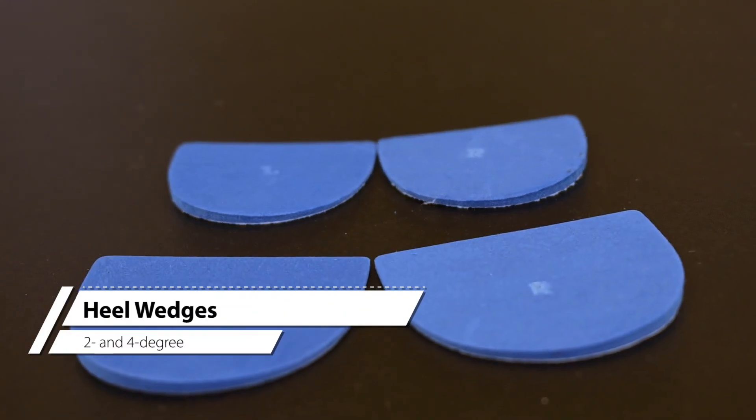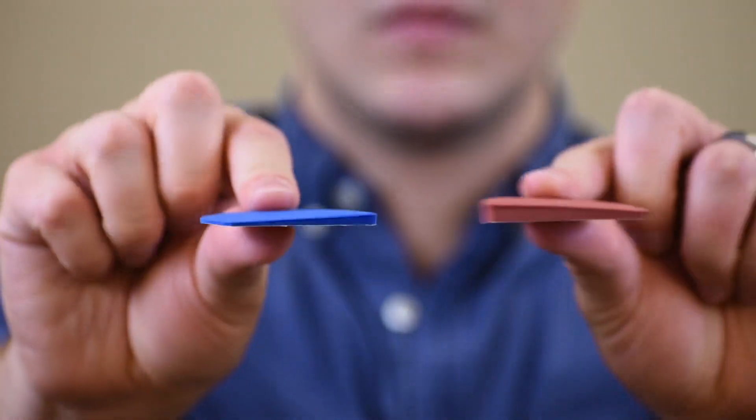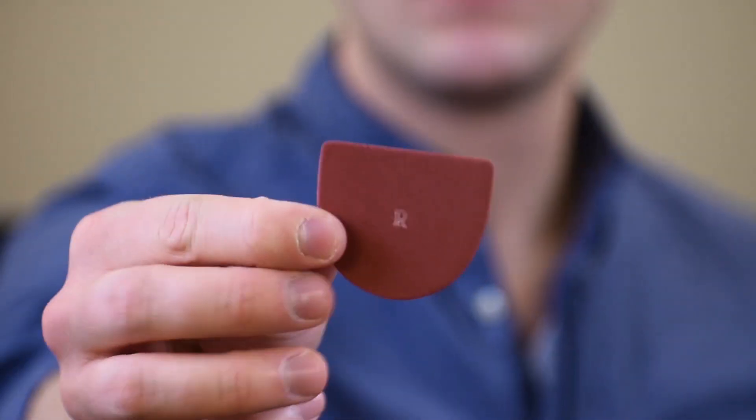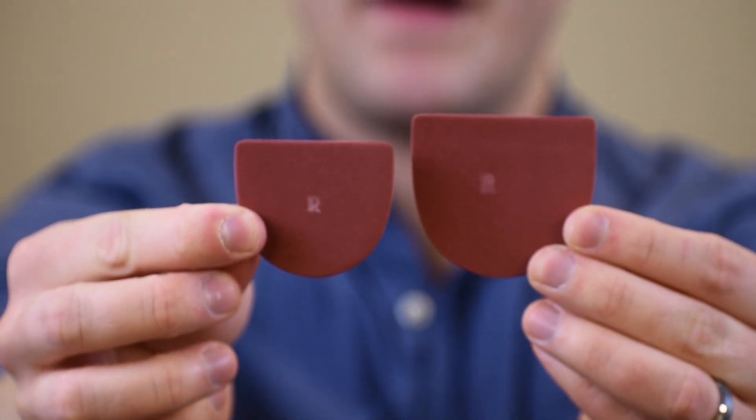Heel wedges are designed to correct pronation and improve foot alignment to alter joint load. We have two different heel wedges: a 2-degree and a 4-degree wedge. Each comes in two sizes — small for most women's sizes and regular for most men's sizes.